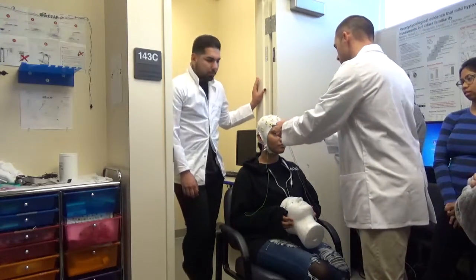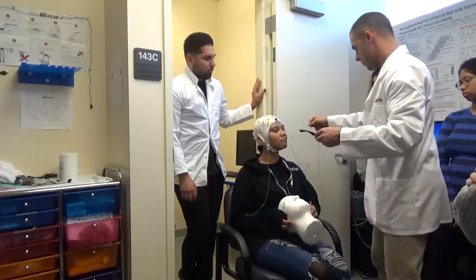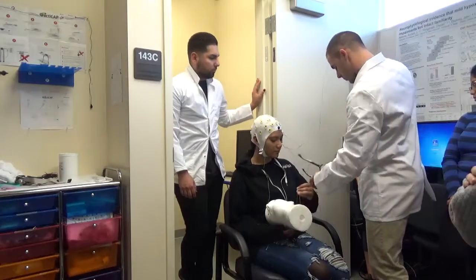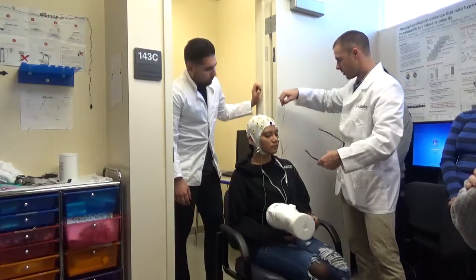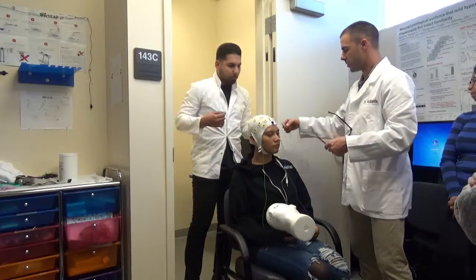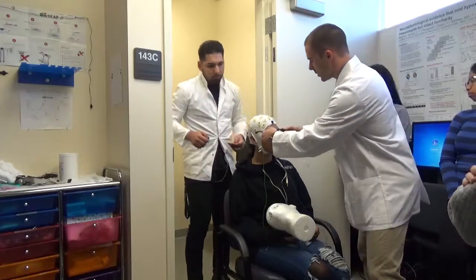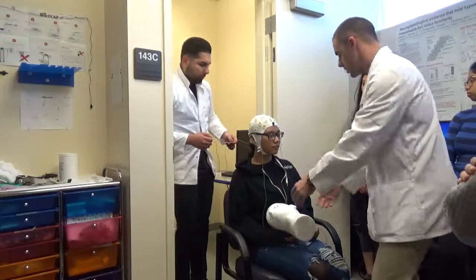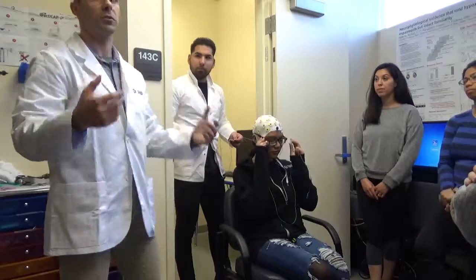And so usually it works better. So first of all, these wires are going to come, can you let go of these for just a second? Okay. You do want to be careful because sometimes they'll drop them on the floor. You can kind of hold that in back there, because this is going to come this way. Okay? And now we can kind of put that there. Does that feel okay? You can adjust that if you need to. All right. Questions?